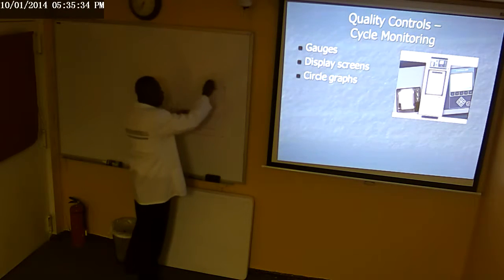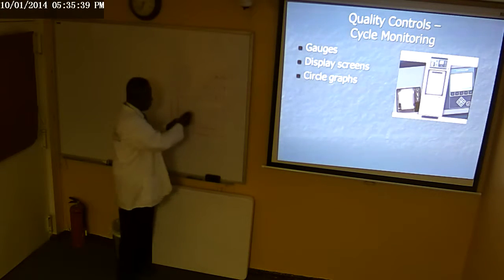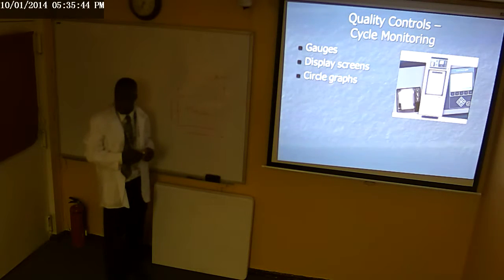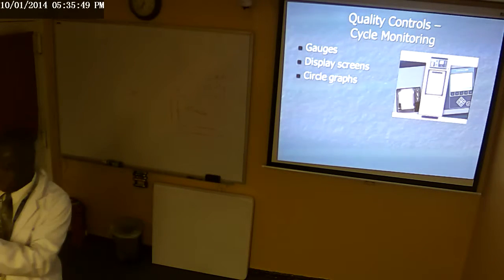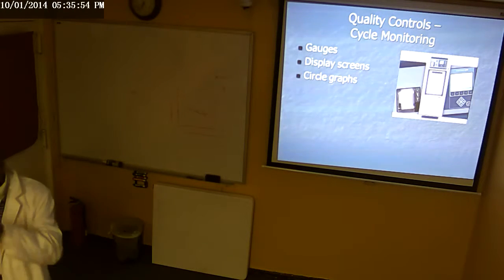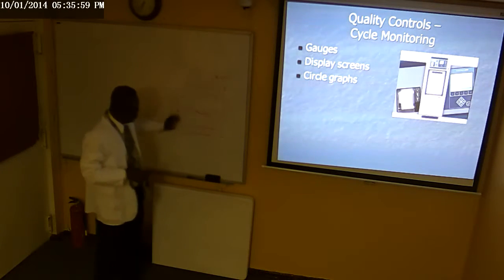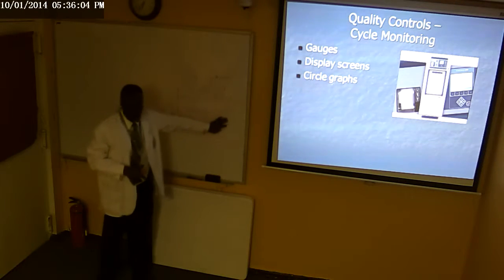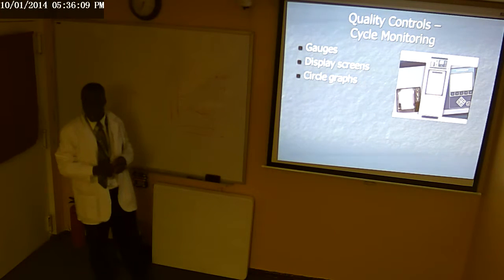And this is the chamber of the sterilizer. If you look at this cabinet, it's like putting another cabinet in there, but you have this space around it. You understand what I'm saying? The space around it is called a jacket. If the door is open and it's empty, there's nothing inside the chamber. But in the jacket, there's always steam to keep the chamber warm. And they have gauges because we have to measure steam pressure.